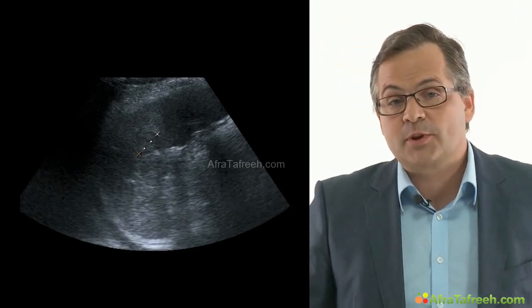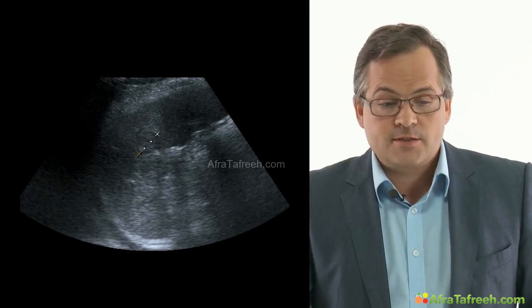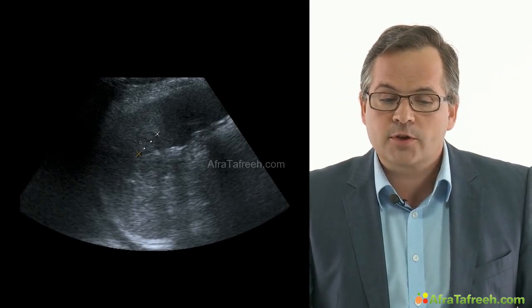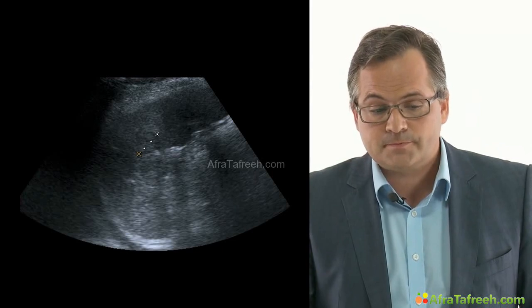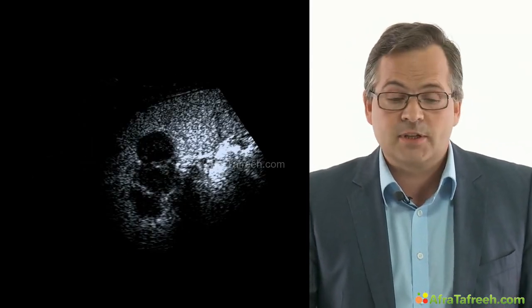Primary tumors of the spleen are rare. In this case, we see a lymphoma. This small tumor over here with a small rim of hypoechoic tissue around, so a so-called target sign. But it's not possible to differentiate between benign and malignant lesions.